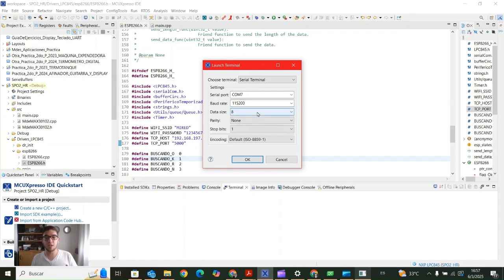If you choose other settings, probably it won't work, or maybe it does work, but you're going to find some problems during the communication or during the measurements, or some errors or whatever. So just maintain these settings. The serial port, however, is set up automatically by the computer. In my case, it's COM7. However, in your computer, it may be different. Okay, we click on OK.